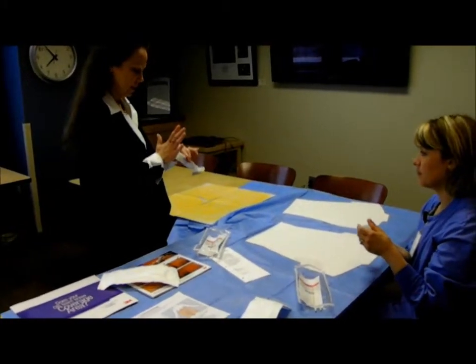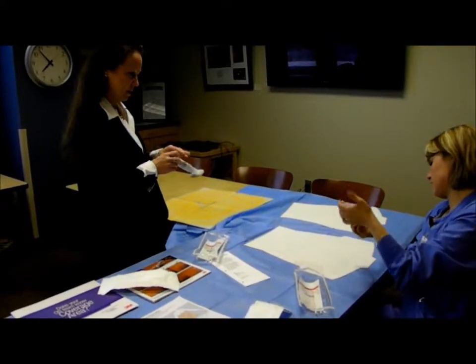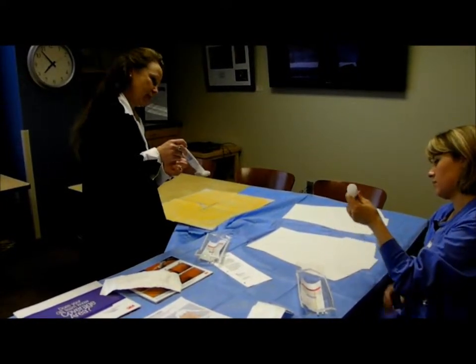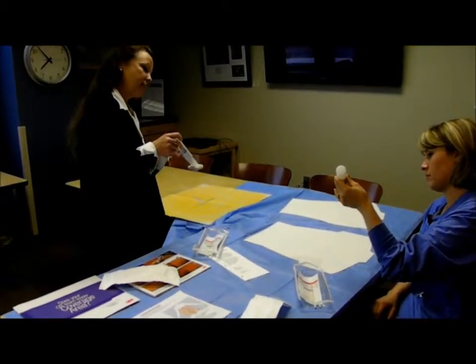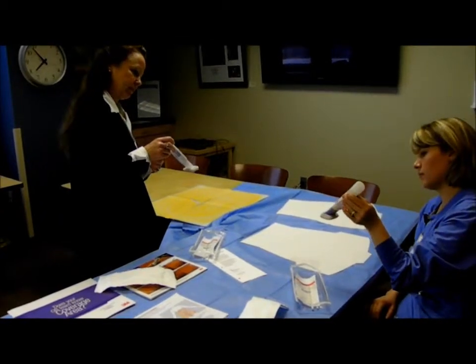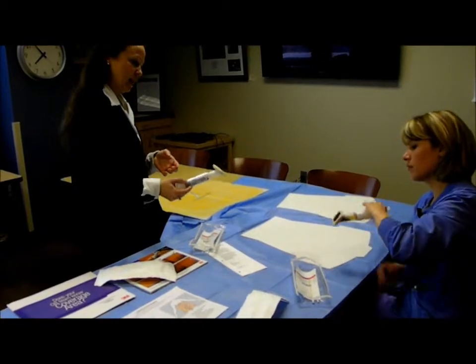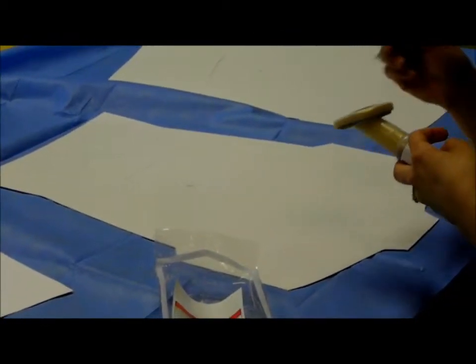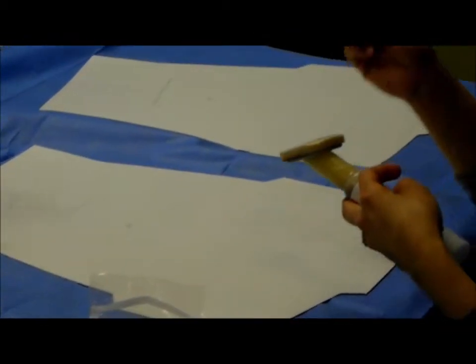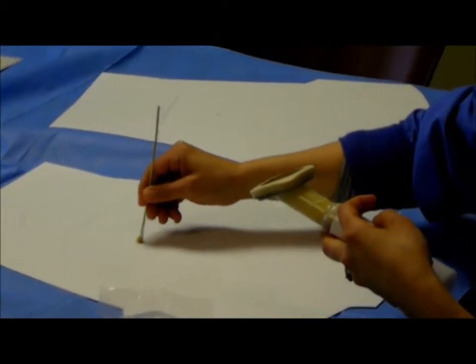So to start the process, we'll go ahead and have you do that. Press, yep, very good. And then you're going to watch it till it goes to the line there, and then you know that your applicator is fully moistened. If you're going to prep the umbilicus, now turn it over, you're at the line, so you have a nice even area there. Take your sterile Q-tips, if you're going to prep the belly button, and just dab that to get some solution. And then if you do the belly button, you just want to do that first. That will be step one.